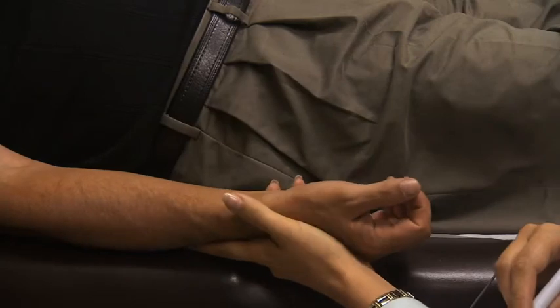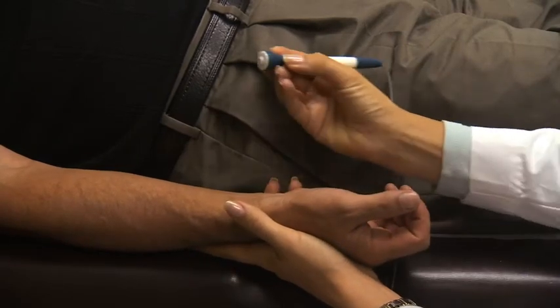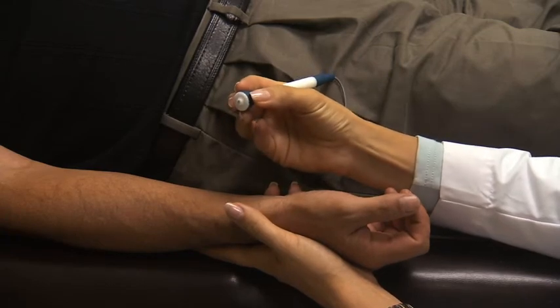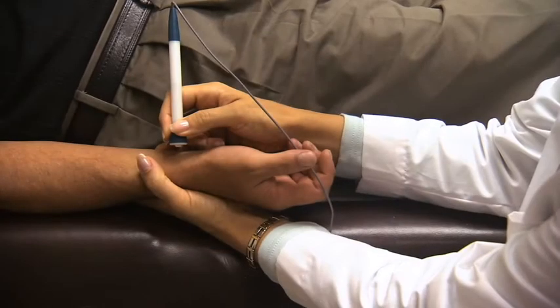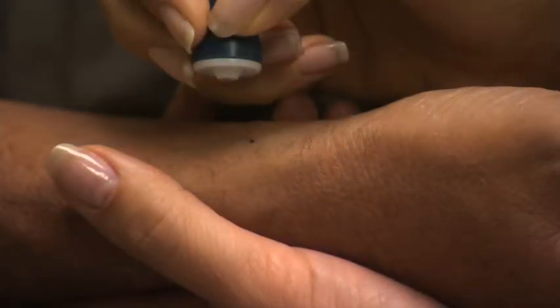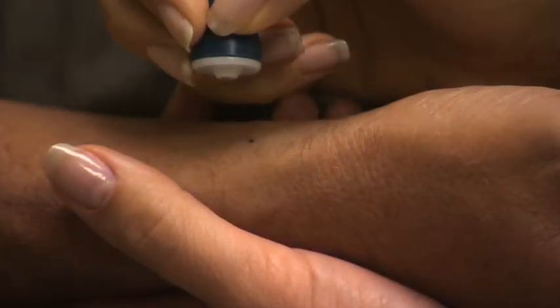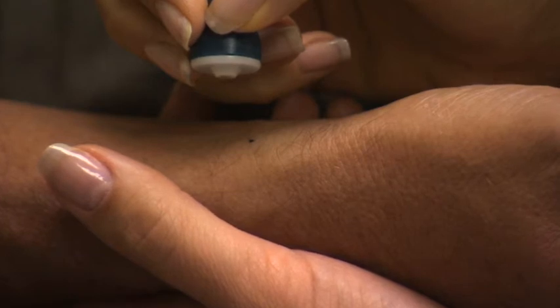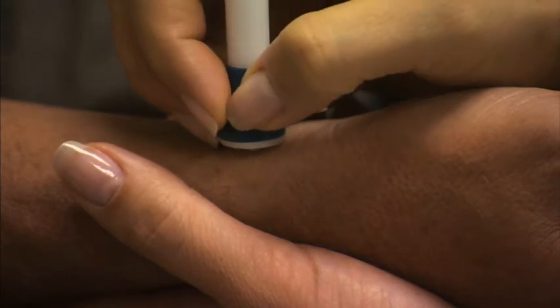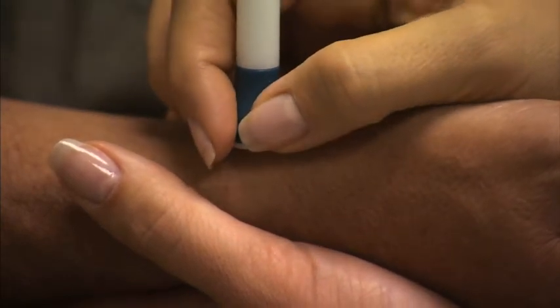Position the tonometer over the site of the strongest pulse point and prepare to take the measurement. Hold the tonometer firmly at the sides of the base, not the shaft, keeping the shaft perpendicular to the skin surface. Hold the tonometer over the strongest pulse point and visualize the dark gray sensing element at the center of the tip. Gently lower the tonometer so that the sensing element touches the strongest pulse point.